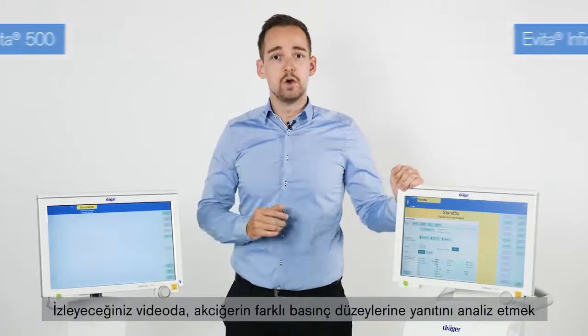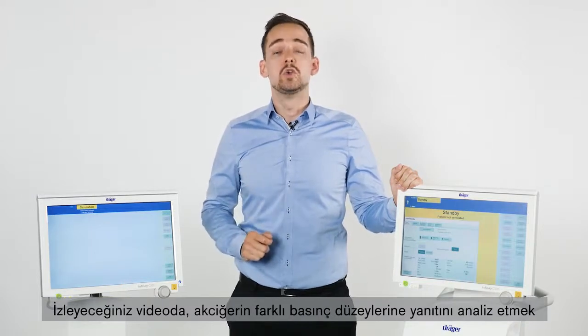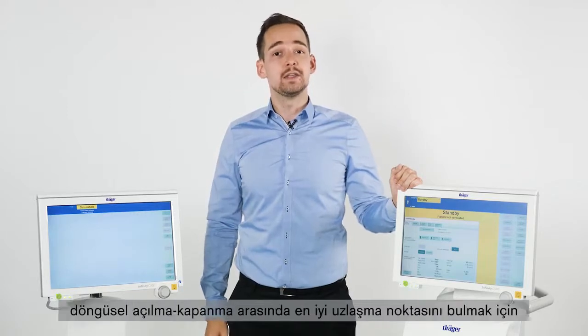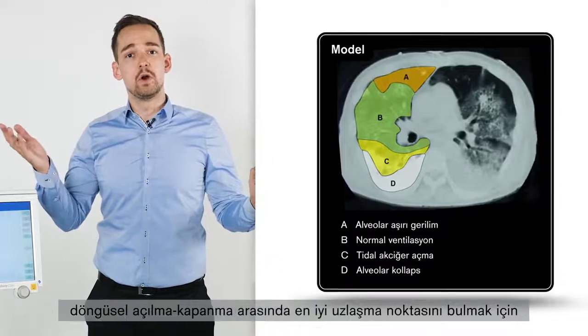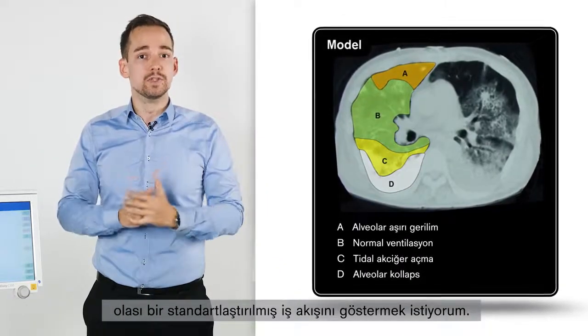In the following video, I want to show you a possible standardized workflow to analyze the lungs' response to different pressure levels and to find the best compromise between alveolar overdistension, collapse, and cyclic opening and closing.